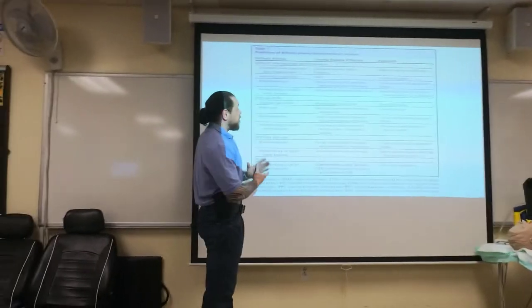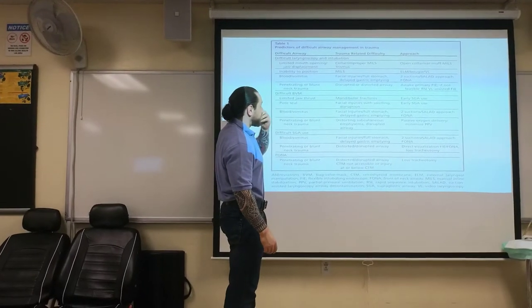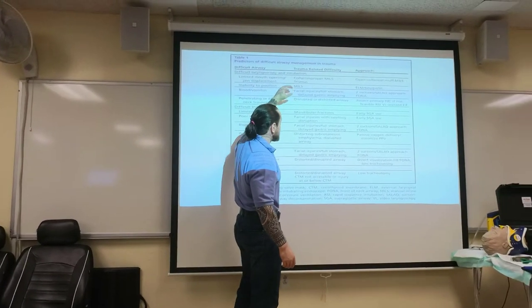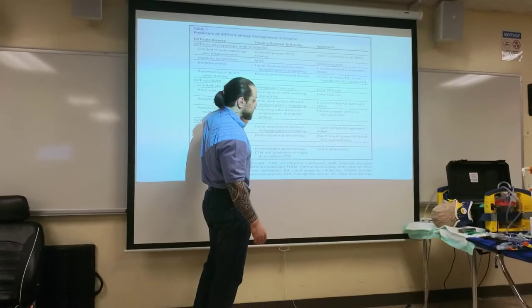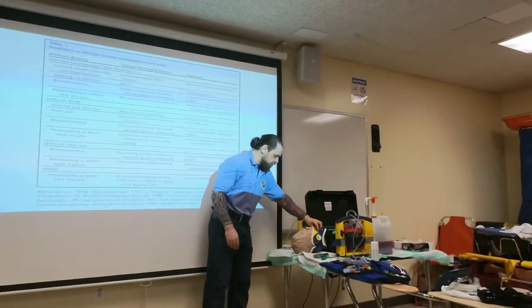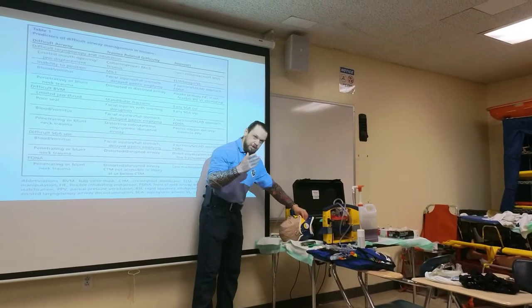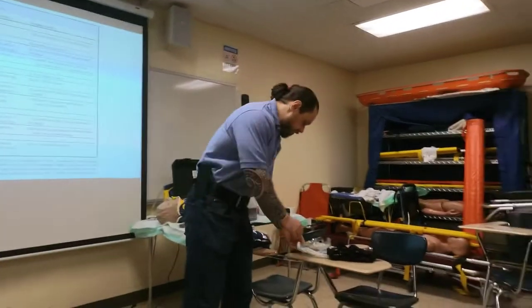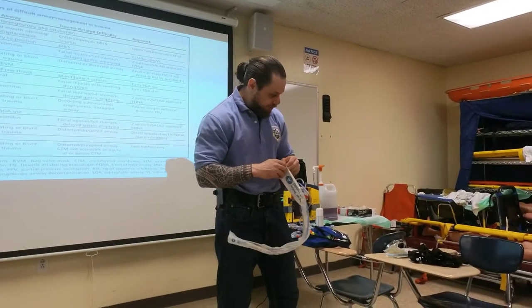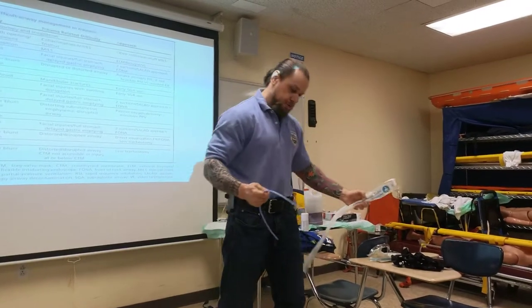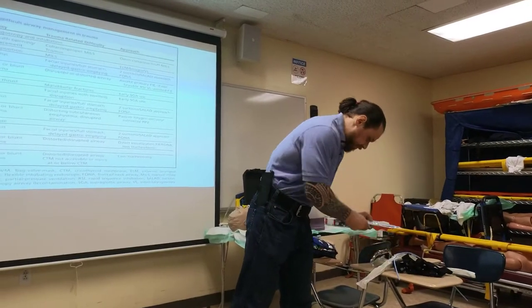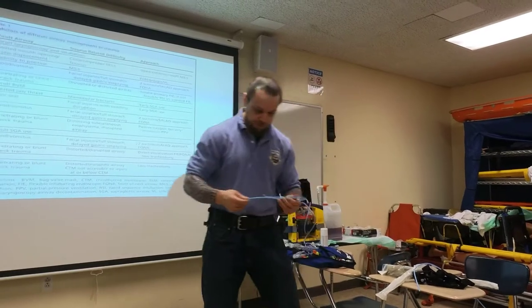So this is the reason why the cervical collar must come off. They also note the possibility of jaw displacement and trismus, especially with head and face injuries. So we have to position them properly and provide manual inline stabilization. To overcome the alignment problem, we're going to do something known as ELM — External Laryngeal Manipulation. That basically means you're using your hand to manipulate the trachea so that it's aligned. The other thing we're going to employ is a bougie — also called an endotracheal tube introducer. Why is this beneficial? It guides you to where you want to go.